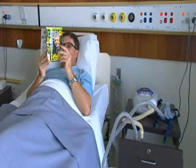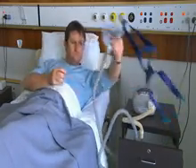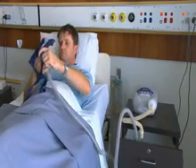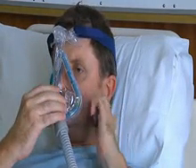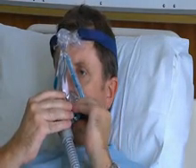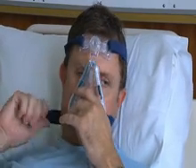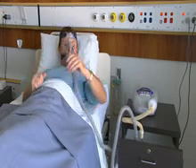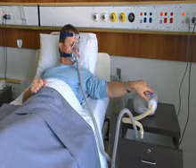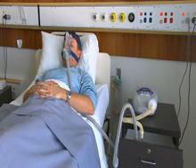Using your ventilator. Apply the mask to your face, ensuring it is centered and firm enough to keep any leaks small. Start your ventilator by pushing the on-off button. If the model shown here is different from yours, refer to your ventilator manual for details of the on-off button.